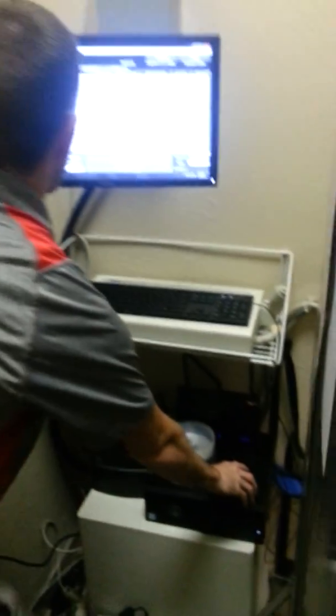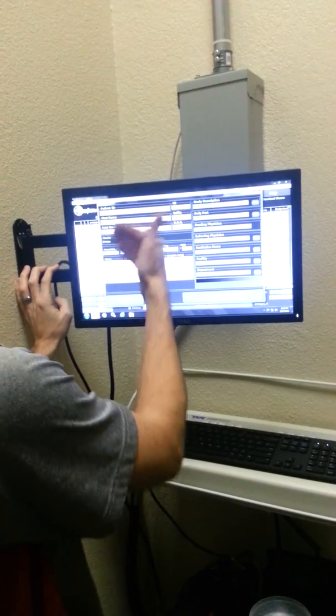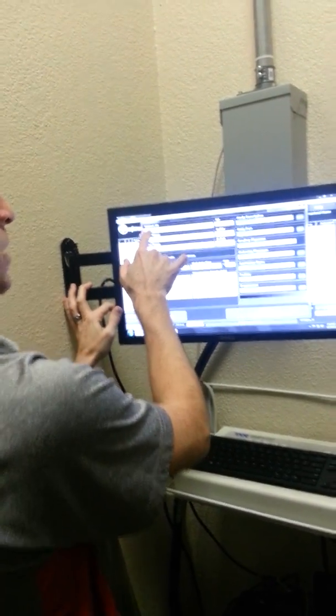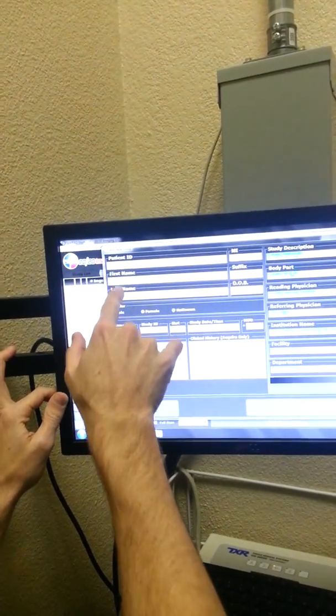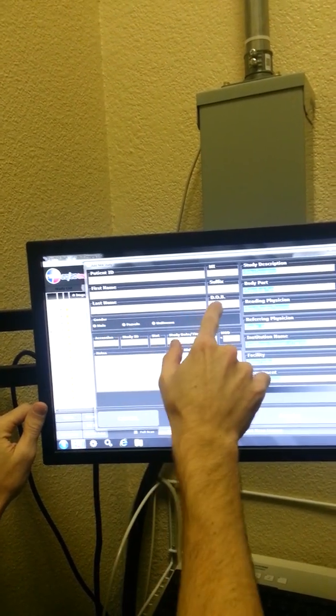It's right here. But what we're going to do, you're going to click on Create New Study, and then it's going to bring this screen up. We got to fill in the patient ID, name, first name, last name. You're going to click male or female, and then we need a date of birth.